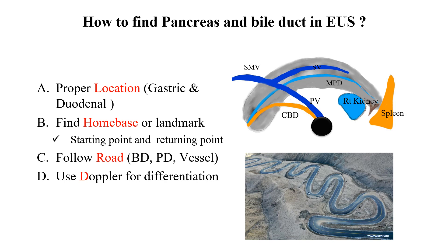A: Proper location for target organs — gastric and duodenal area. B: Find a home base or landmark. This home base is the starting point and returning point for echo endoscope movement. C: Follow the road — like bile duct, pancreas duct, and vessels. D: We can use color flow for differentiation between bile duct and vessels.